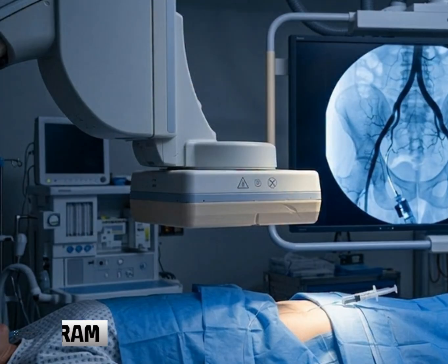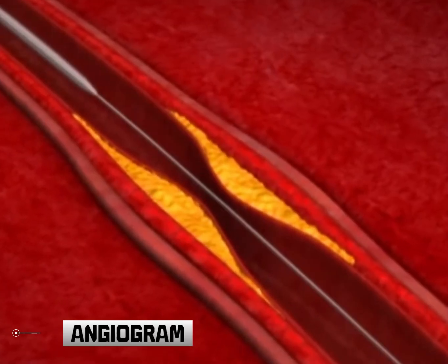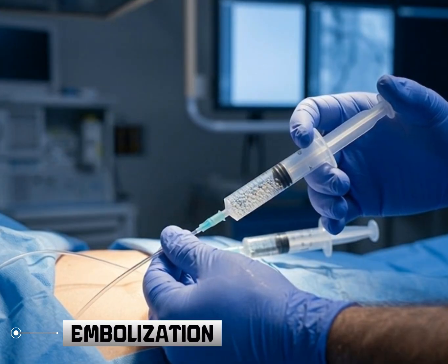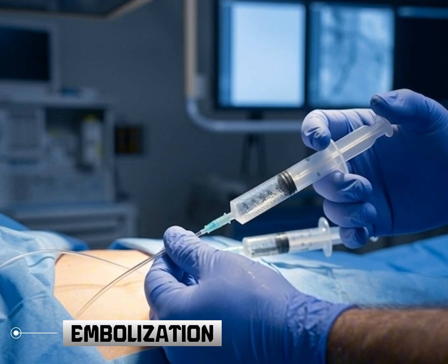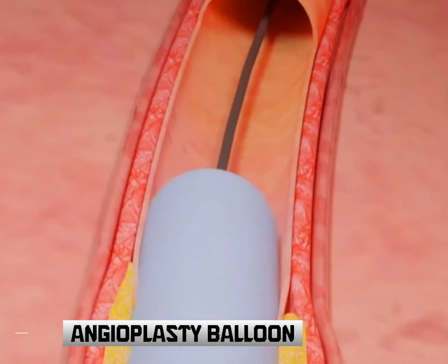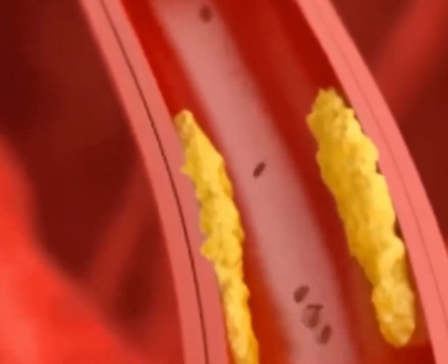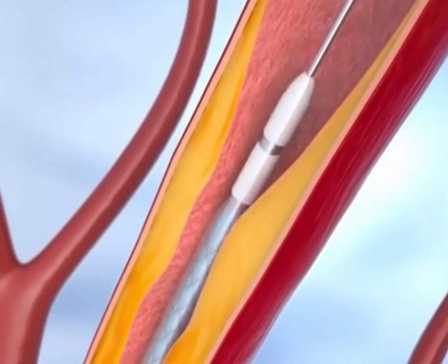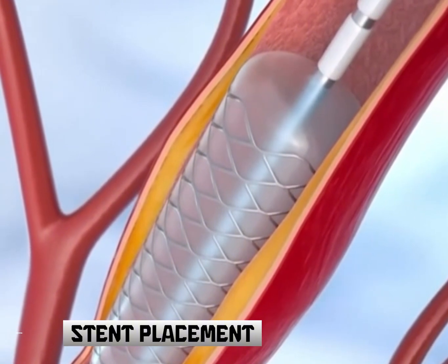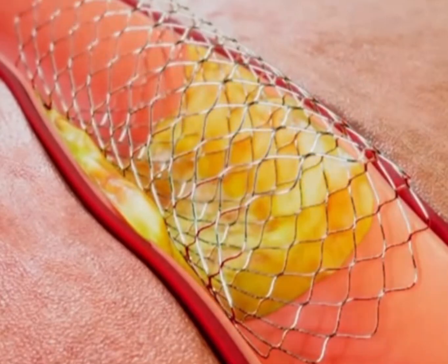And for the angiogram, contrast dye is injected to see the blood vessels and to confirm the position itself. And the fifth one is the embolization. Tiny particles are injected through the catheter to block blood flow to the fibroids. And the next step is a balloon attached to the catheter is inflated to open the blockage, as you can see there. And finally, the stent may be placed to help keep the artery open and improve the blood flow.